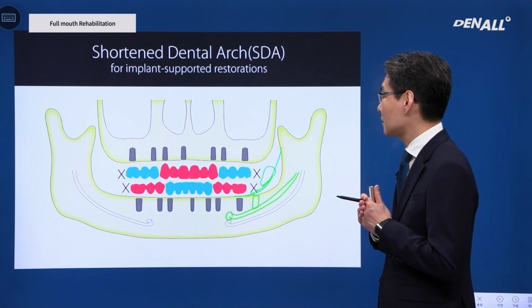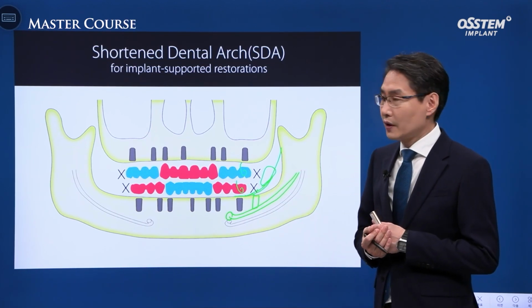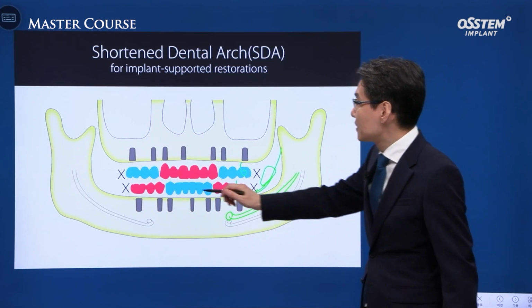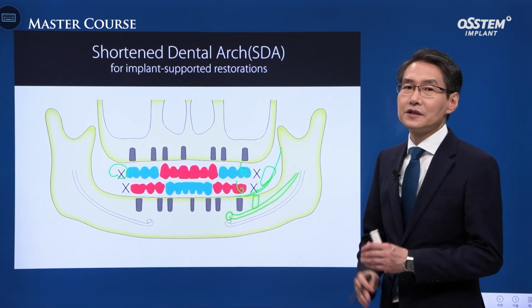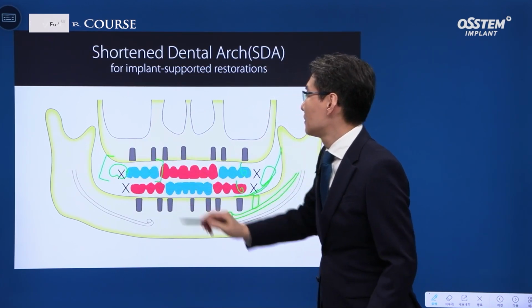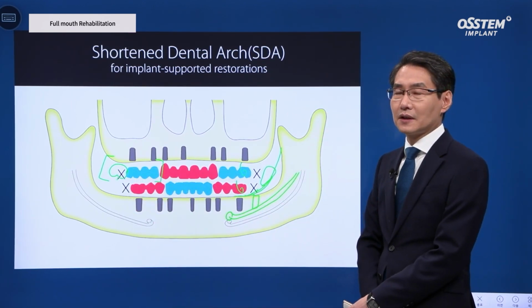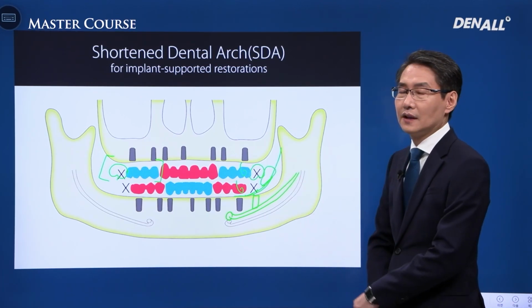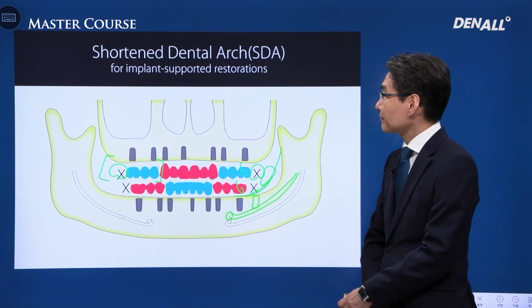In that case, you can skip number 7 and provide restorations only up to the first molar and provide 12 units. You can skip number 7 in both upper and lower. The upper is more effective, but you can also form distal cantilever for the upper number 7. 4 teeth are formed like this. There's no antagonist for the cantilever, and it is not subject to force, so this is a very stable design. The pontic number 7 provides a cheek support, and it provides comfort to the patients.